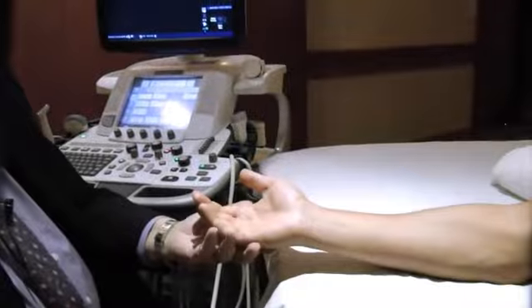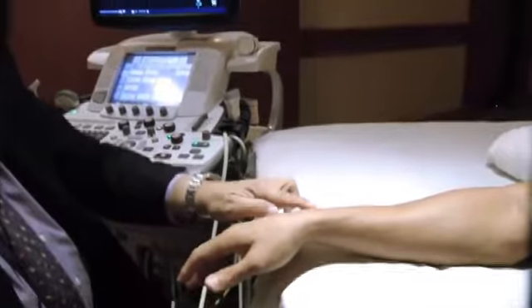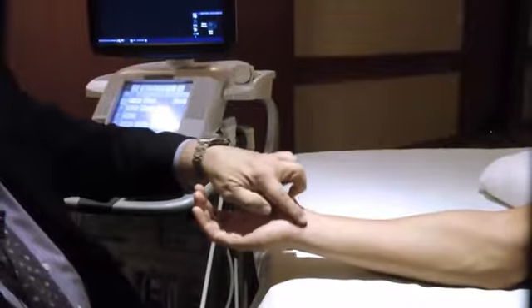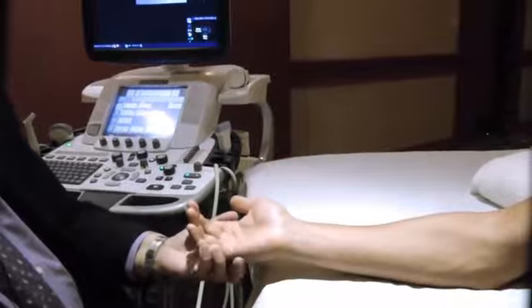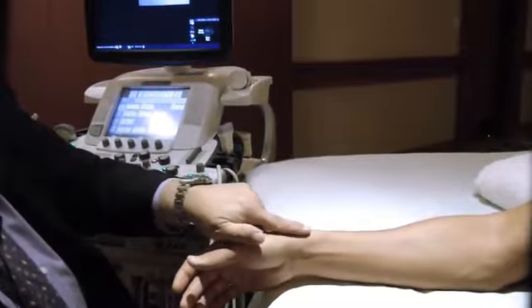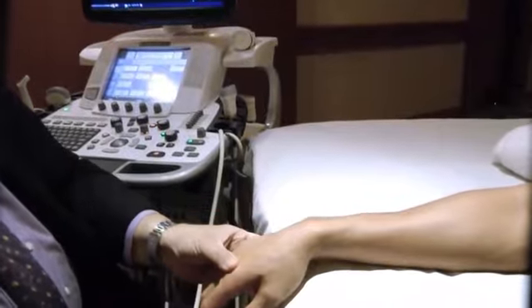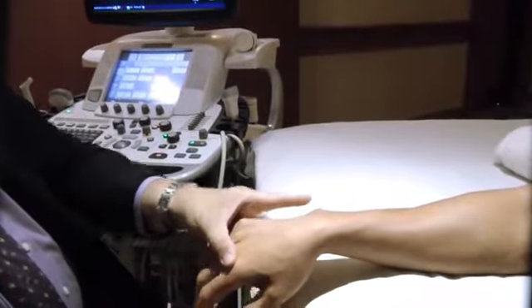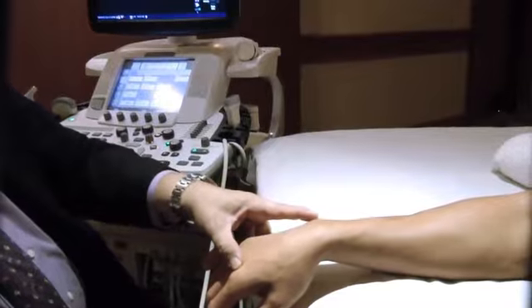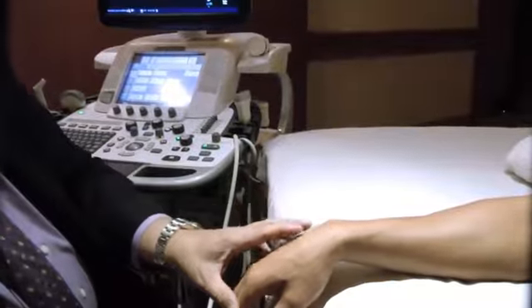For the hand and fingers, it's the same four-quadrant display wherein the extensor region is on the dorsum of the hand. Then you have the flexor region, which is another quadrant that you could look at. Then you have the radial area, especially for the first compartment of the extensor region for de Quervain's disease. And last but not least, you can take a look at the fourth quadrant for the extensor carpi ulnaris and the distal radio-ulnar joint. The acronym is DRUDGE.